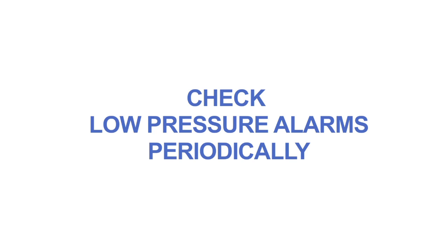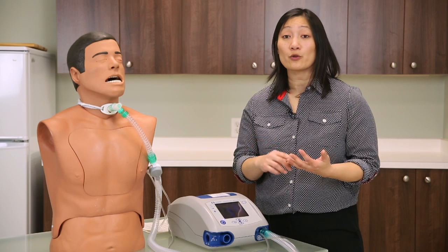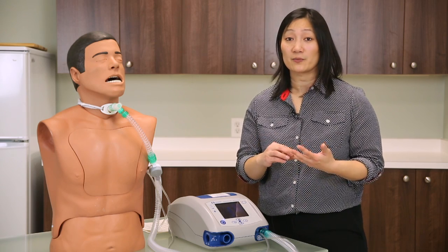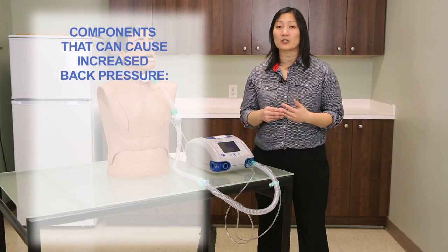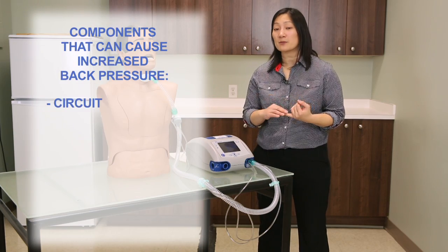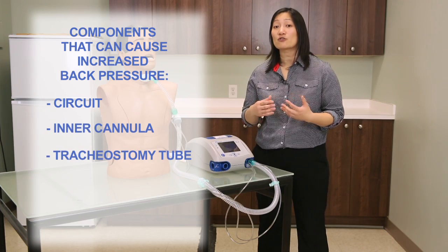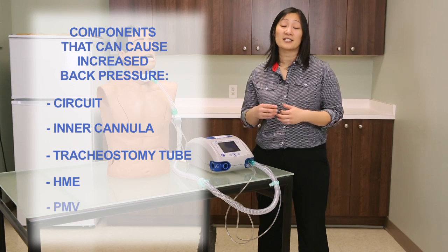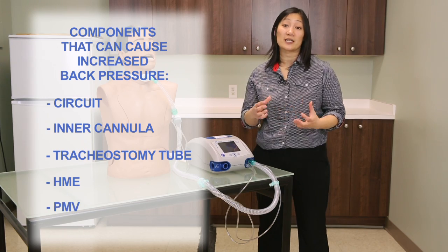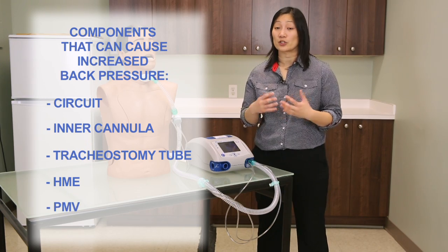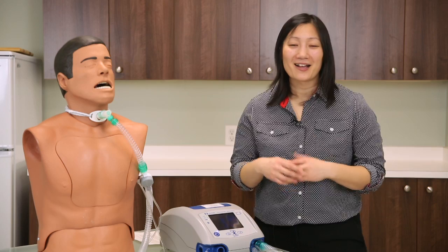The low pressure alarm should be checked periodically on your ventilator for both your bedside and chair ventilator. If you make any changes to your ventilator by adding a Passy Muir valve or an HME into the circuit, you should also check your low pressure alarm, as these things could create increased back pressure and change your low pressure alarm settings.